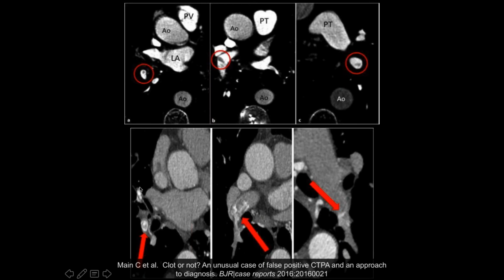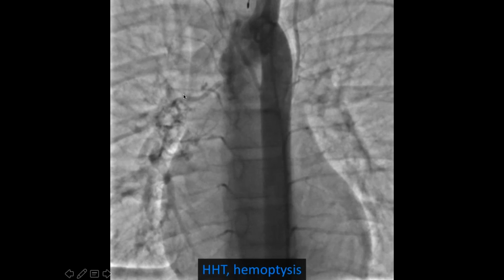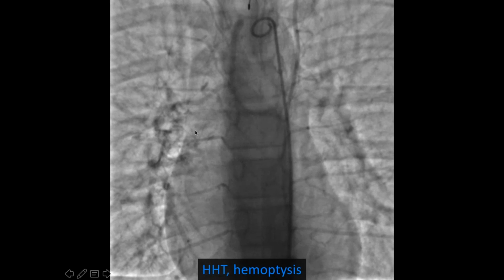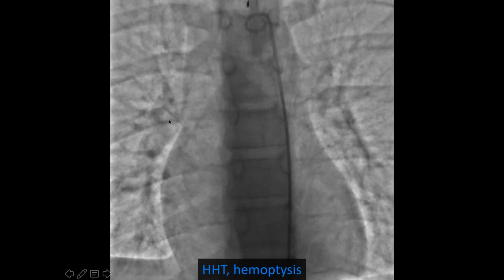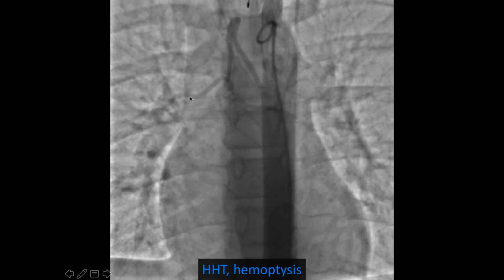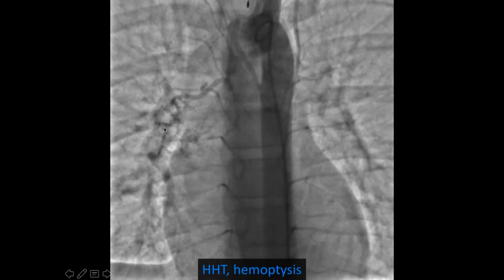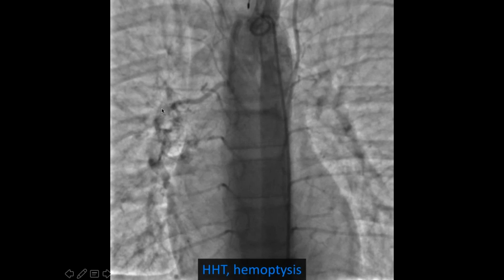So I think bronchial artery inflow means that there is, I'm just thinking out loud here, a direct communication between a bronchial artery and that portion of the pulmonary artery. Yes. And does that just happen spontaneously, or is it known to happen even with the relatively large vessels? It happens. I was talking to one of my senior attendings that used to do angiograms all the time, and he said it was very frequent that you would see anastomoses, usually around the segmental or the subsegmental level, especially in patients with bronchiectasis. Okay. And here's an angio that I found.